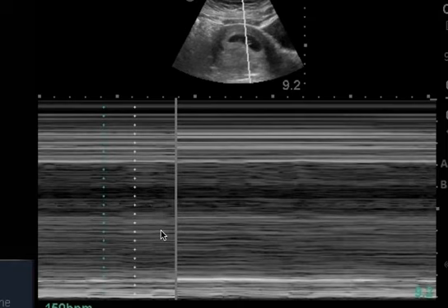And what does this mean exactly? Everything you see illustrates movement that the machine is processing throughout time. So there's no movement of the skin in soft tissue, which is why on the top you see a barcode. As you get down towards the heart, which moves through time, you're going to start to see peaks and troughs, which is indeed the fetal heart rate.